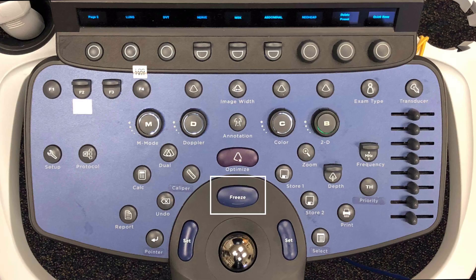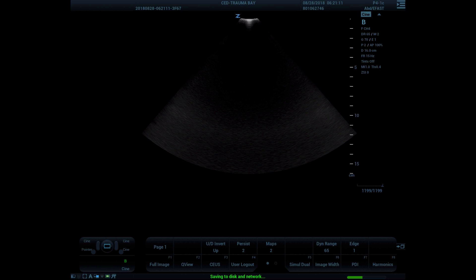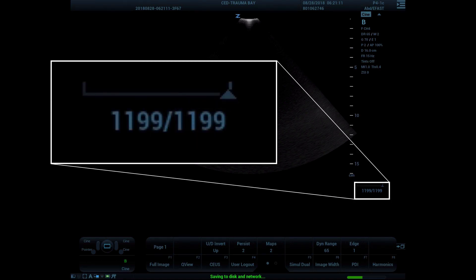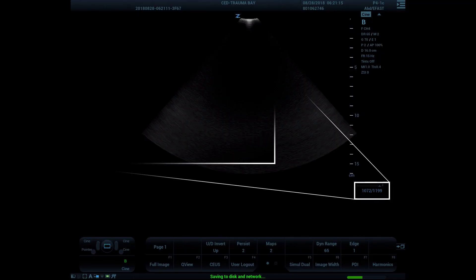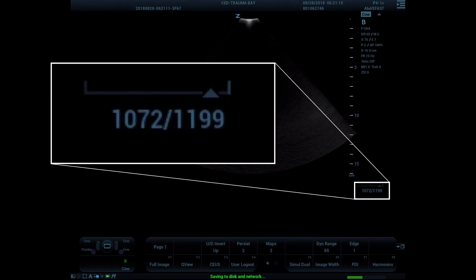There will be some times where you need to freeze your image and manipulate the cine loop. The freeze button is located right above the trackball. If you have a frozen image, the lower portion of the screen will display the cine loop, showing how many frames are temporarily stored. You can use the trackball to scroll forward or backward in the cine loop to find the image you want. As you scroll through, you will see the image you are displaying from the cine loop — in this example, we are on frame 1072 of 1199.